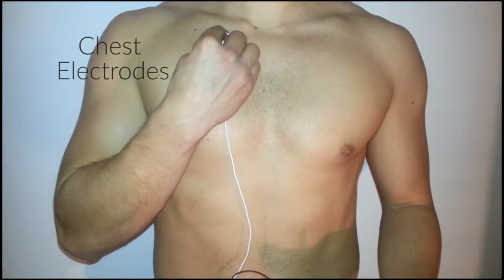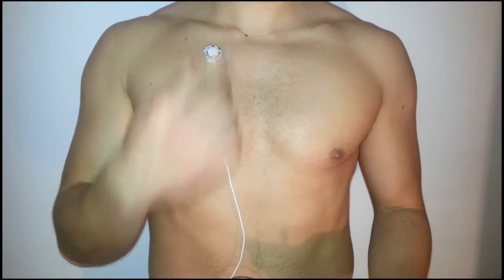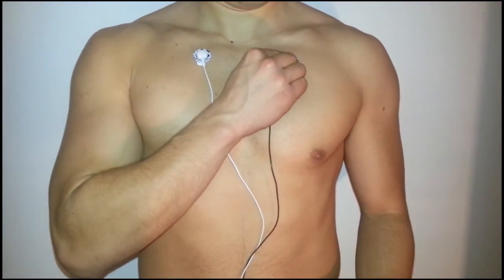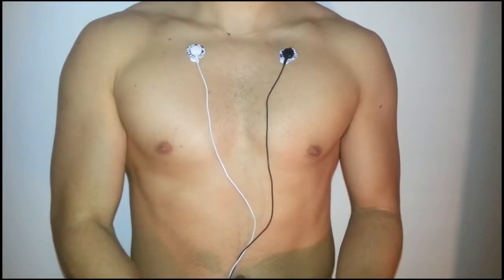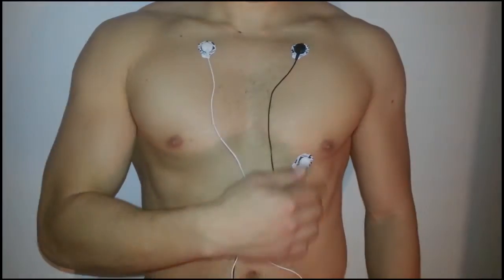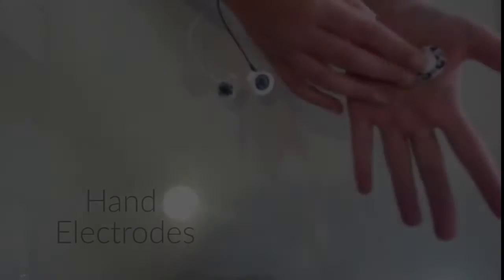Chest electrodes: place the positive electrode on the top right part of your chest, the ground electrode on the top left part of your chest, and the negative electrode on the bottom left part of your chest.